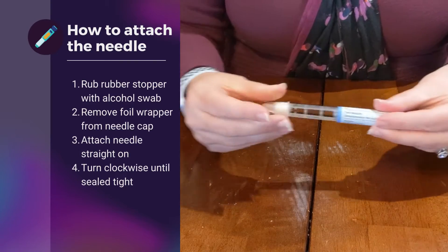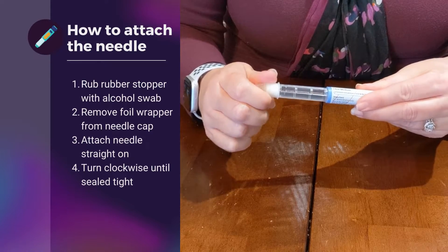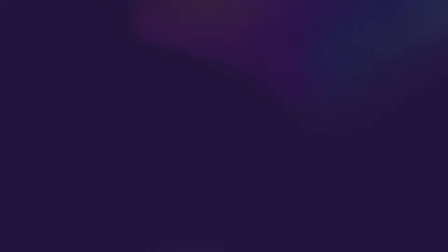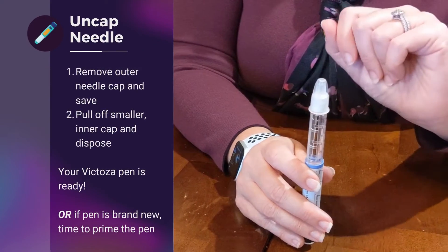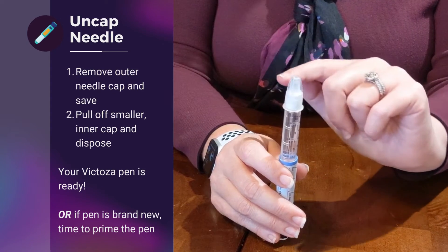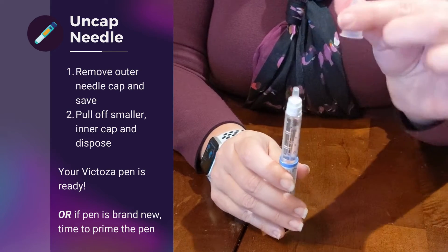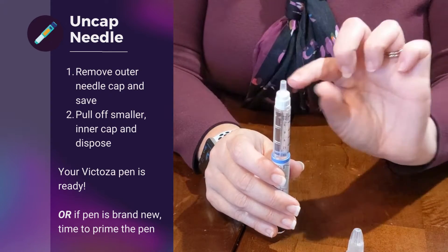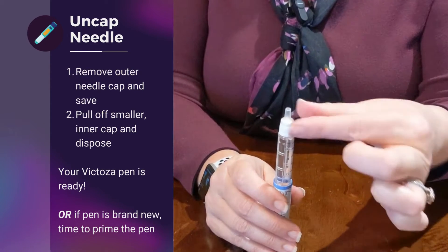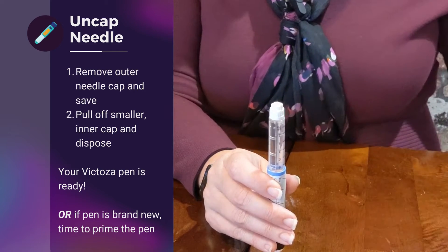We'll screw it tight, and once it gets pretty tight, give it one more turn — that way we're going to prevent any medication from leaking out. The outer cap is going to come off, but remember that this cap needs to be saved for when you're finished with your injection to remove the needle. You're going to now see an inner cap — it could be clear or a little thinner. Pull this off, and this inner cap goes in the trash immediately.